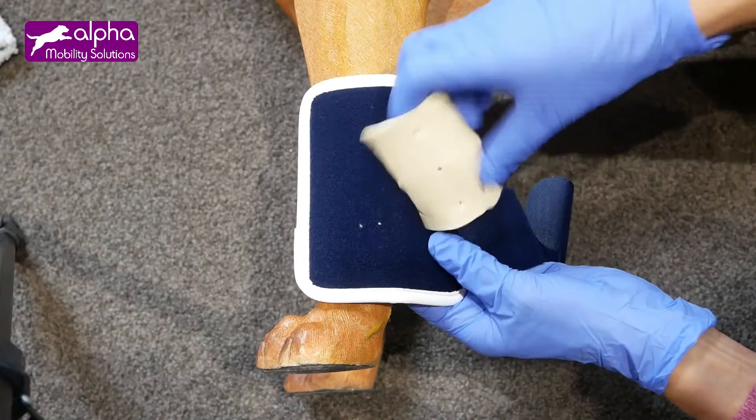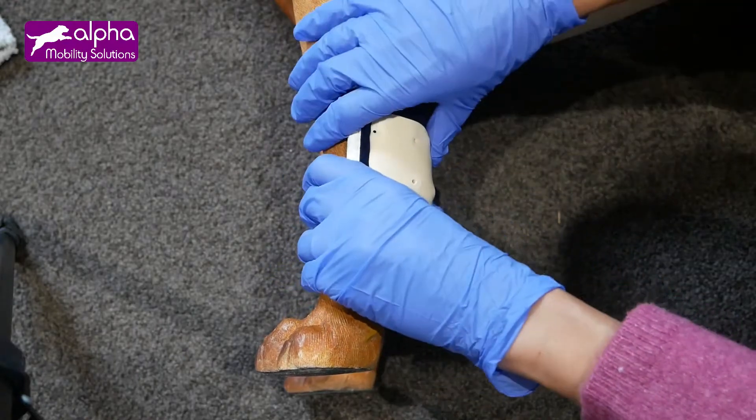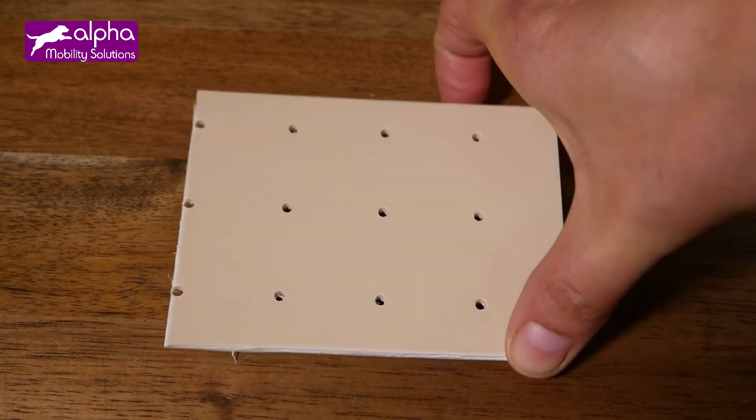I will show you how to add a low thermoplastic splint to a simple leg wrap and transform it into a custom-made carpal brace for your dog. At normal temperature, the splint is rigid.